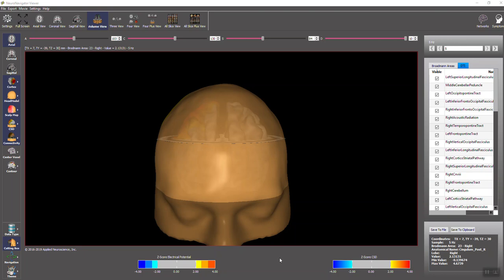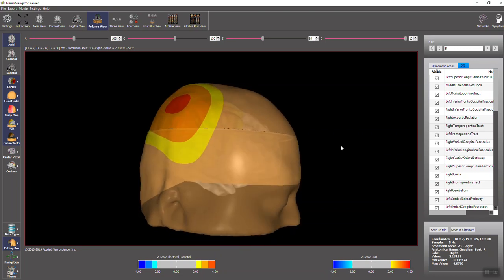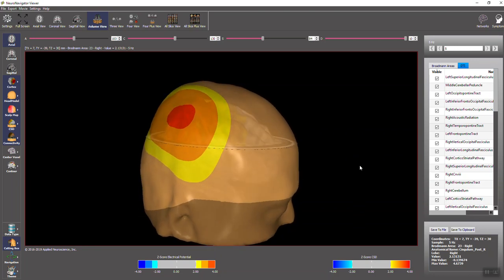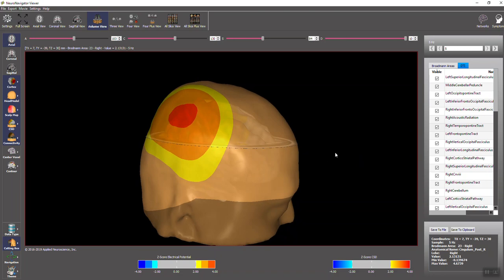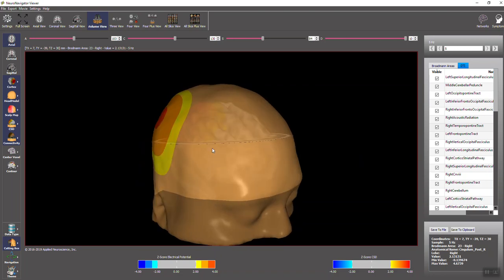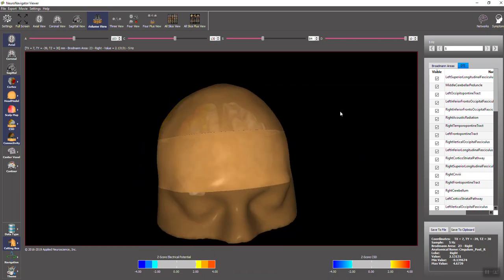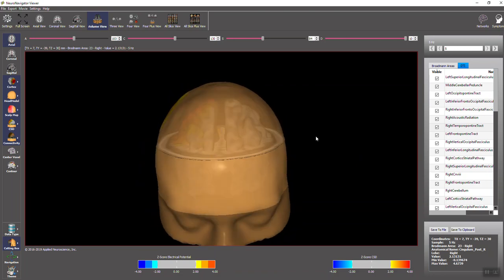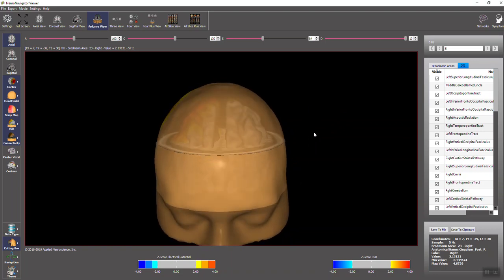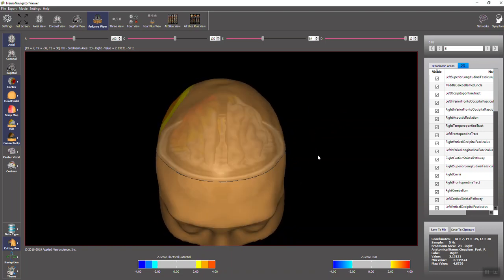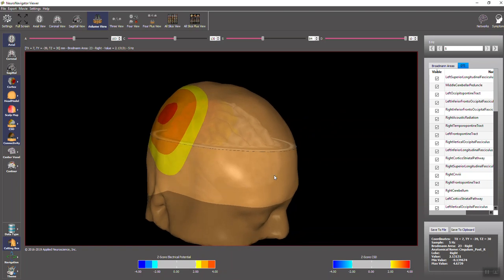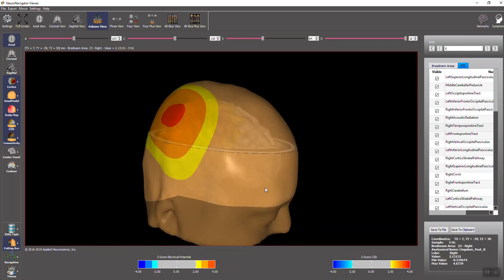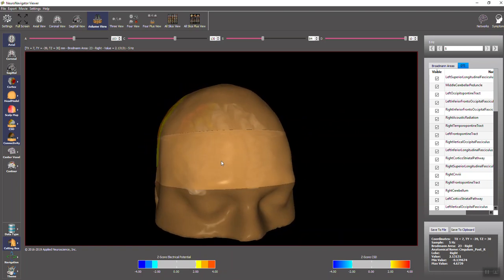This is a video to demonstrate the addition of diffusion tensor imaging to the NeuroNavigator. This is the demo patient who was struck on the right parietal region and has symptoms such as paralysis on the left, does not shave the left side of his face, and you can see the scalp potential. Z-score is significantly deviant from normal in the right parietal region.